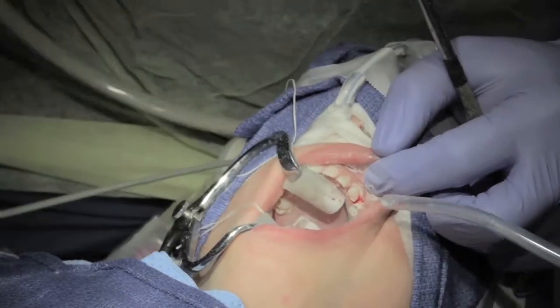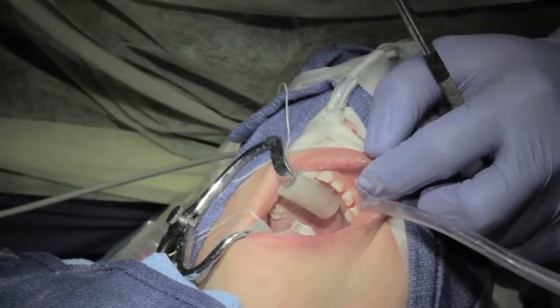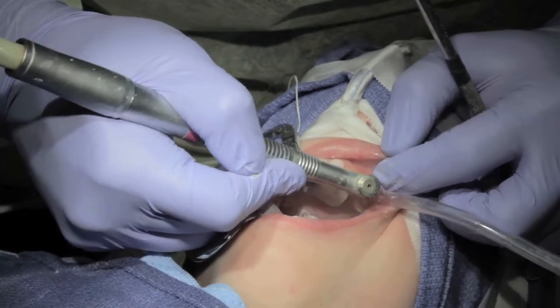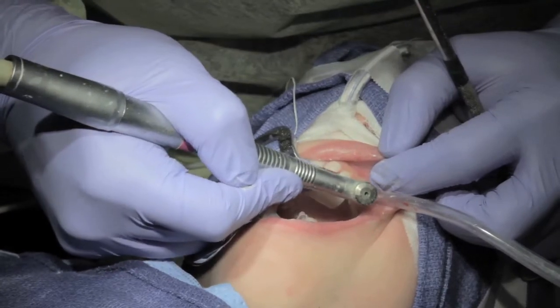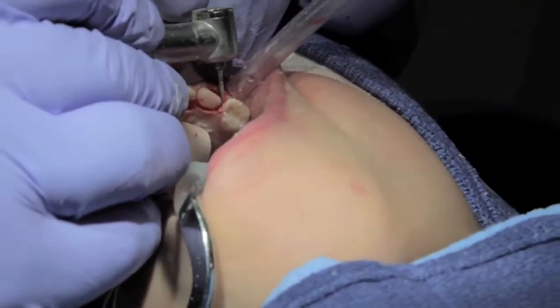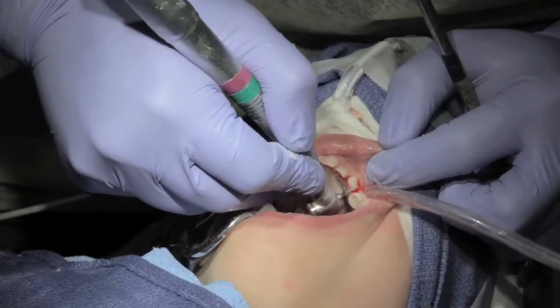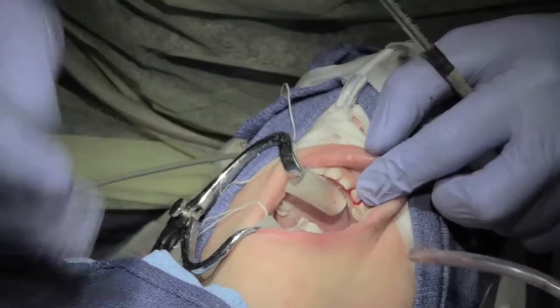You just have to adjust your reduction depending on where the decay is and how extensive it is. There's still a little bit here but I'll address that in a second. Then what I do is bevel the lingual, because the shapes of the crown are similar to a natural tooth and have that lingual bevel. When I go through, I make sure there are no sharp angles anywhere. Then I'll just touch up that one spot that has a little extra decay.